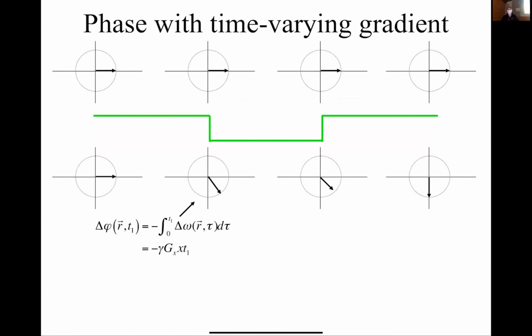Now, the interesting thing about MR is the spins, as we said before, do exactly what you tell them to do. So they actually have a memory. So for example, if I come along with the same spin and I give it a gradient, it's at some phase here, say negative 45 degrees. But now I turn off my gradient. I say, okay, you're going to go back to the isocenter in terms of frequency. You're not going to be offset in frequency anymore. And I come back and look, this spin keeps the phase. So it remembers where it was.